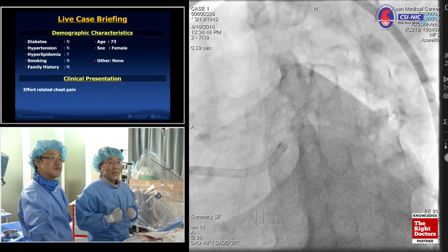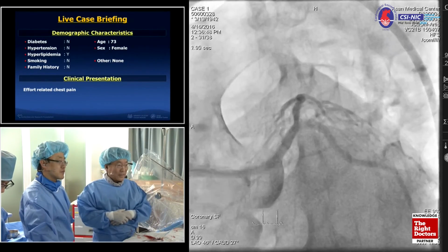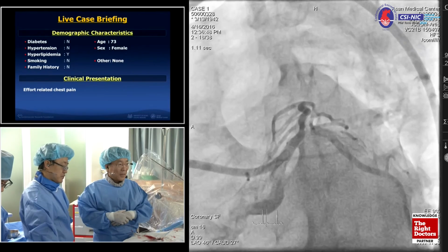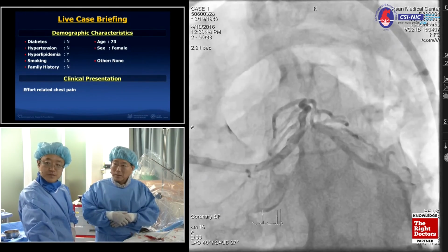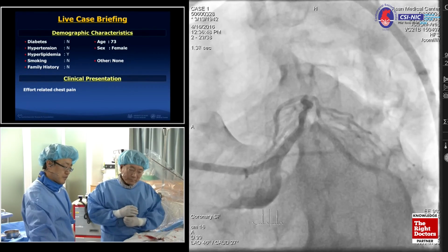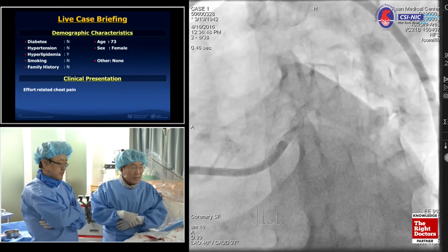Any other suggestion for that? Have you thought about using dedicated stents, in particular in this case, using a Triton stent, because it's almost like having less metal in the left main?